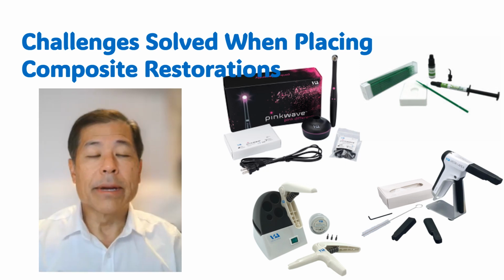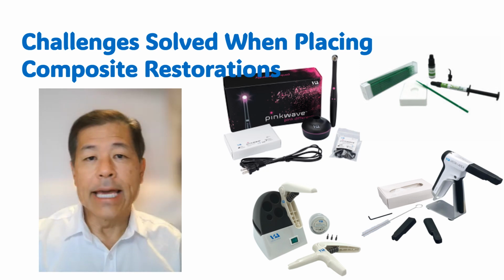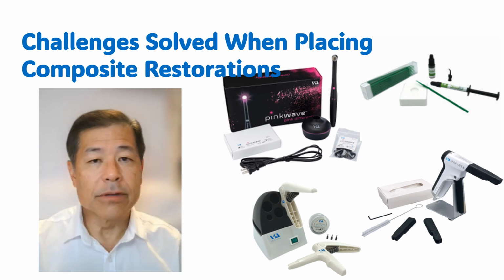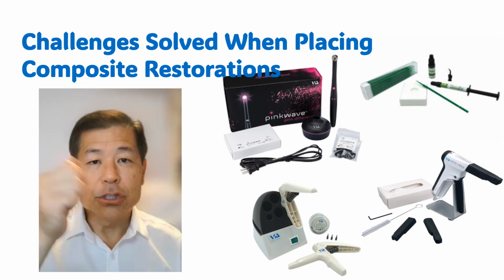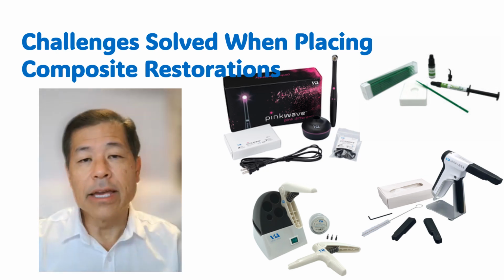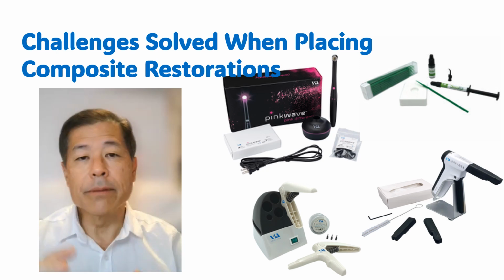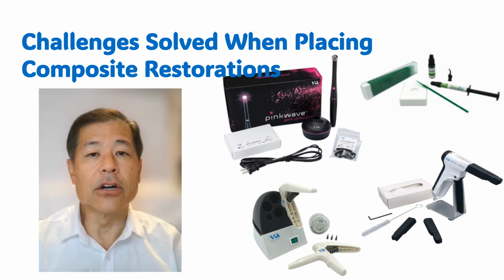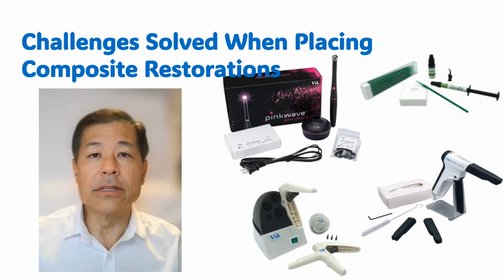So I'm going to warm my composite up. I'm going to place it on the prepared tooth, and then I'm going to use my seam-free with any composite instrument. I don't even have a special composite instrument. And I just spread that composite out and then contour it. The seam-free and the warmth of the composite helps me do that. And then I'll cure it with my pink wave curing light. And it becomes very, very efficient. So let's take a look at how this will work.